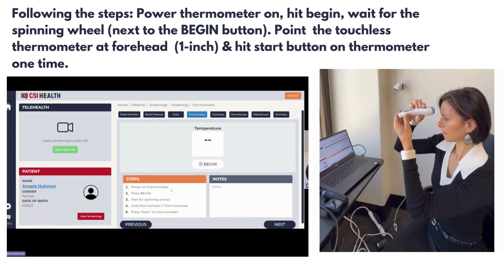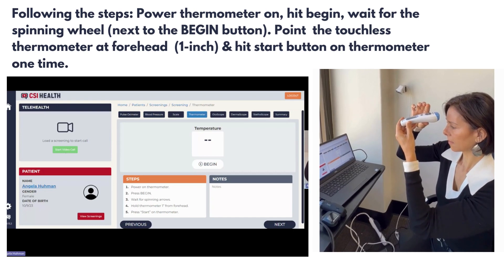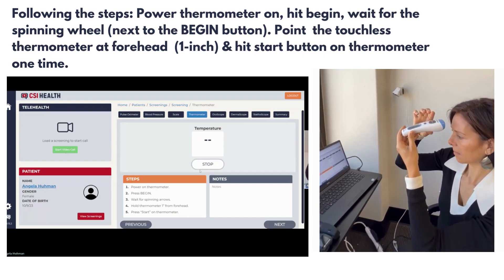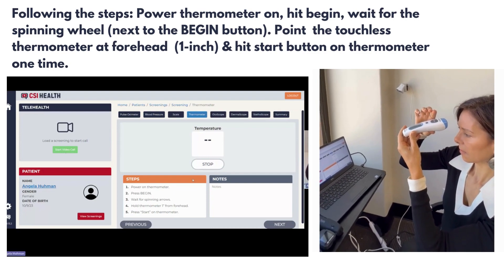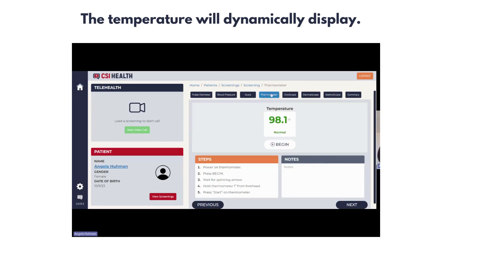Following the instructions, power the thermometer on, press begin, and wait for the spinning arrow. Once the spinning arrows start, hold the thermometer one inch from the patient or student's head and press the start button only once.